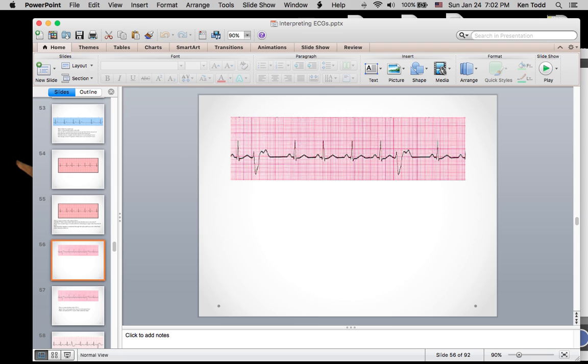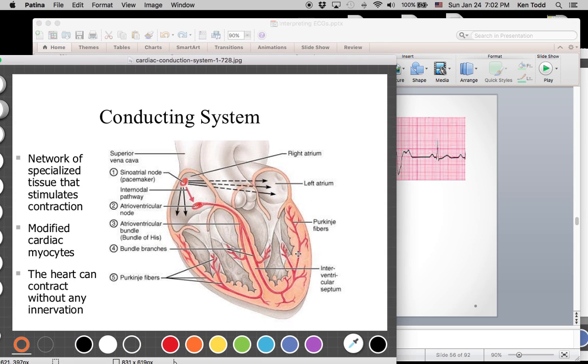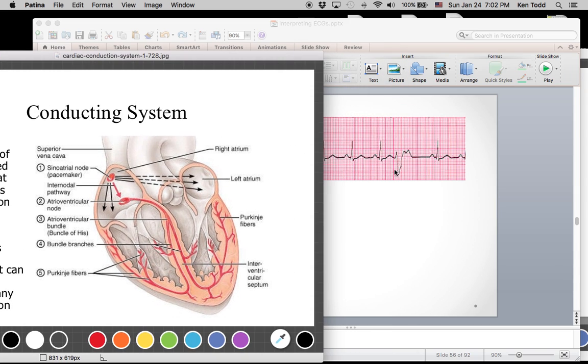In other words, I have one site somewhere down here in the ventricle that's becoming ischemic, that's starting the signal going this way. Pretend this was lead 2, and you can see that my deflection is much more negative, so most of my energy is going towards the negative electrode. So it's probably starting from somewhere lower down here in the ventricle.